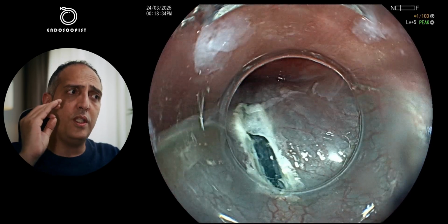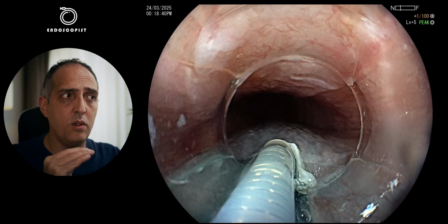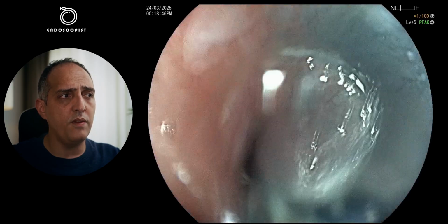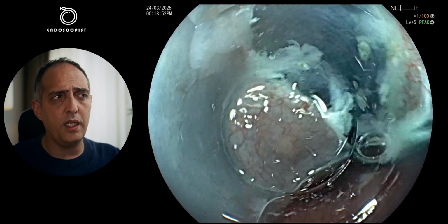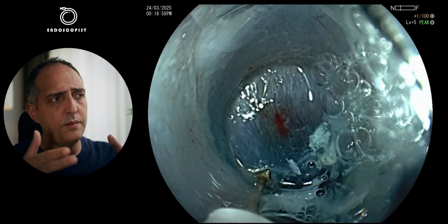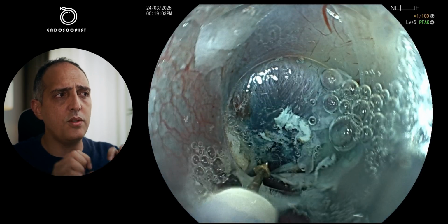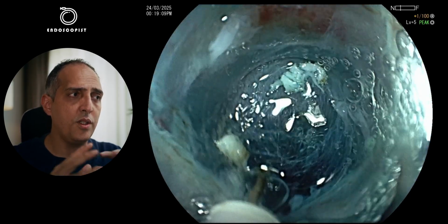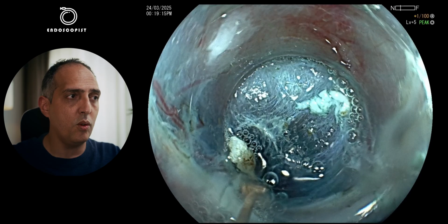Very important to go deep with the first cut in the submucosa to make sure that you cut already the muscularis mucosa, which will fasten and help you to enter the tunnel very quickly. After I did about 1 to 1.5 centimeter mucosal cut, usually I keep it small so I can close it easily, I go with my cap, which is a conical cap from Fuji. I go with the cap, do some pressure on the edges, and I give some spray coagulation just to dissect the submucosa and loosen it up a little bit, which will help me to enter the space of the submucosa easily.